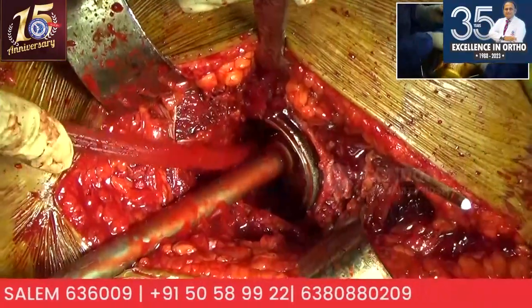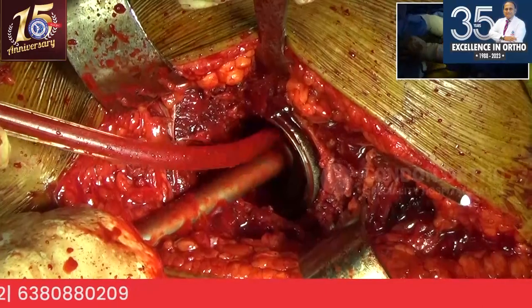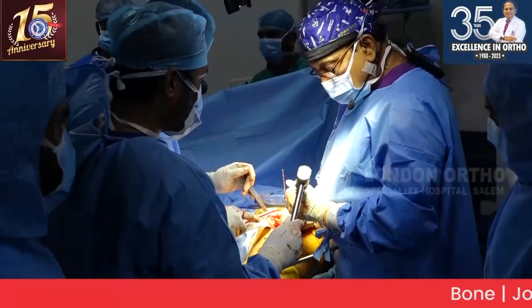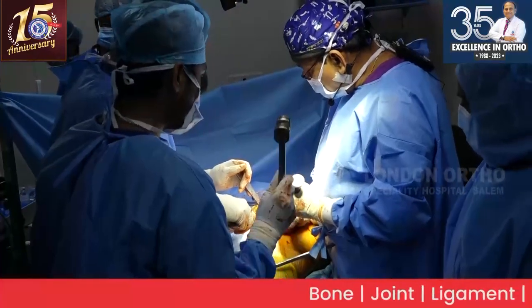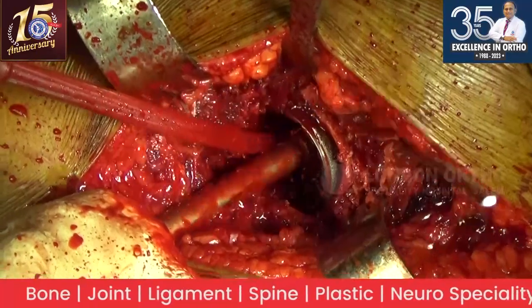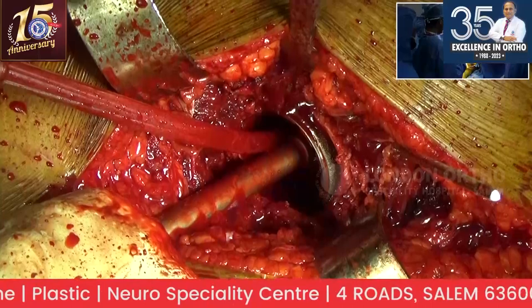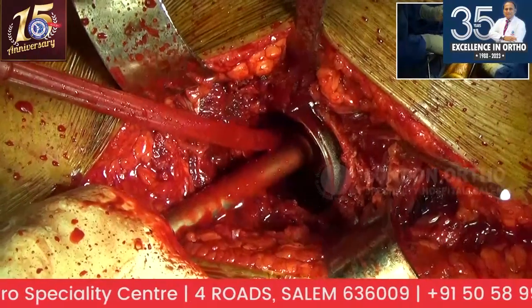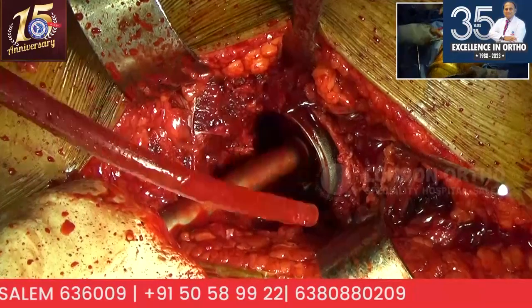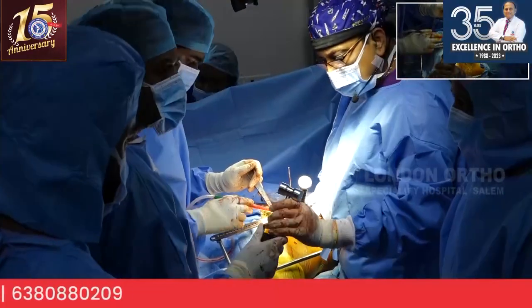Sugonam, do you always allow your assistant to hit the cup? Yes, I hold it tight. And the person from here has to hit it. It's a bit worrying that somebody new might hit it a little harder. Well, I have both hands, so I know. Usually, my regular assistant hits it. Every hit, I direct it. When I say yes only, they can do it again. Okay. Do it, yeah. We don't actually have a heavy hammer. Is it a cluster hole cup or multi hole? It's a three hole. Three hole.